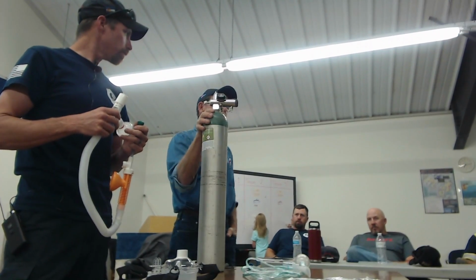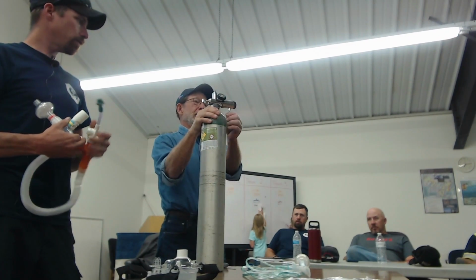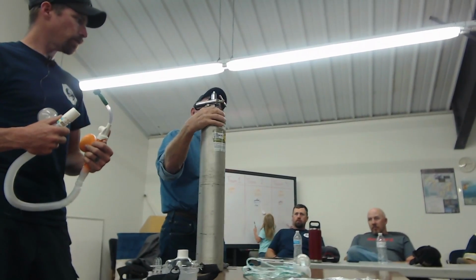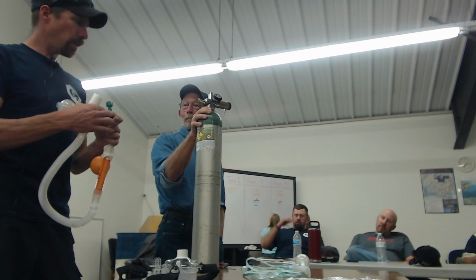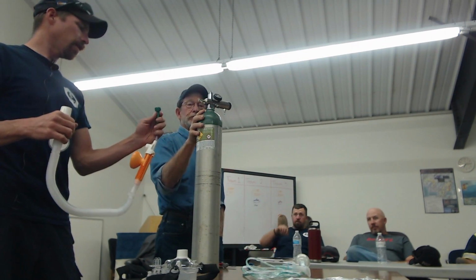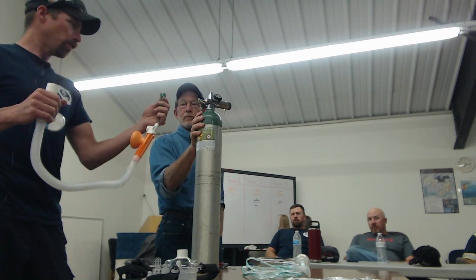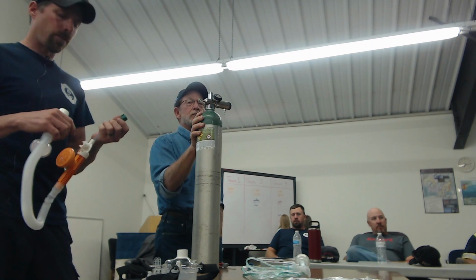Yep. So yeah, super, super critical. And especially if you're in the rig, don't be tempted to use the one that goes through the regulator. Use high flow, high pressure. It'll be somewhat difficult to make that mistake. I mean, this is rigid plastic, so it's not going to want to go on that little barb connection, but I suppose it could be a mistake that was made. So just know that this has got to be hooked to the high pressure.